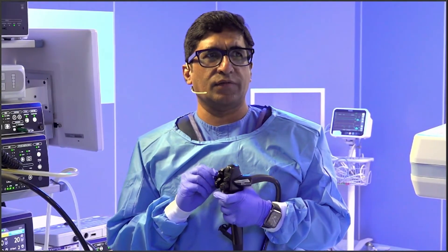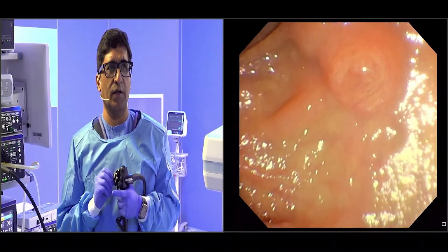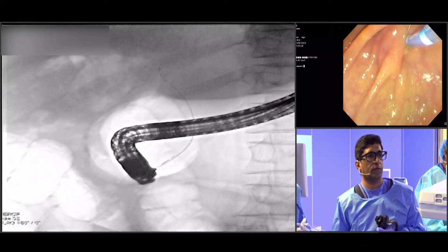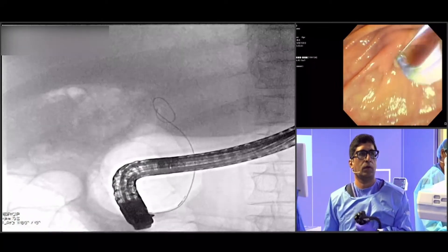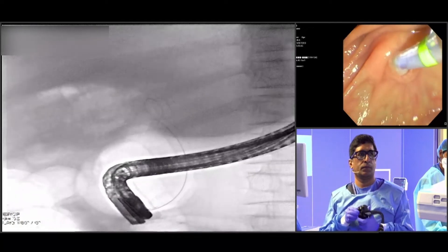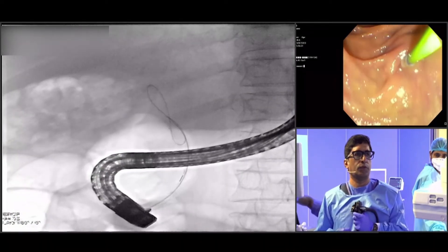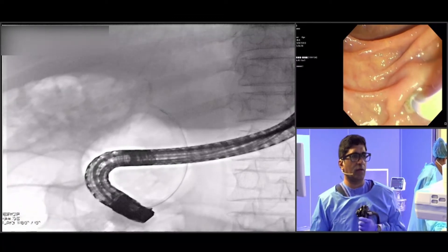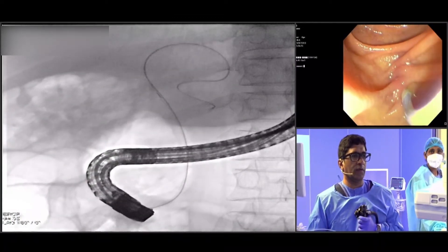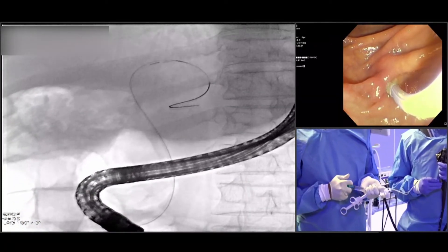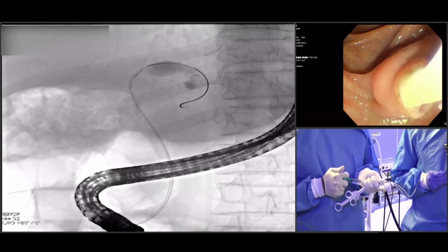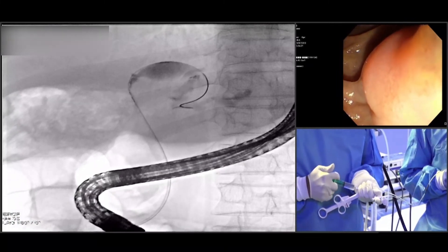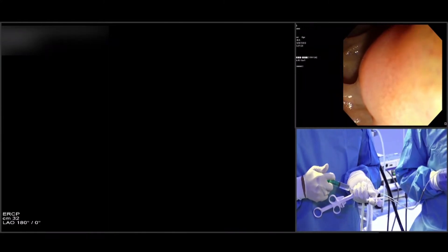The aim is to demonstrate the conventional method of tissue sampling, which is very important to establish the diagnosis. We are now in the bile duct. We push the sphincterotome up and negotiate the wire across the stricture. We have gone into the left hepatic duct — this is drainage from the left deep intrahepatic duct. We can see the very dilated left hepatic duct and, coming down, there is a tight stricture.